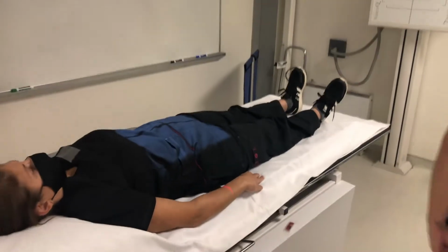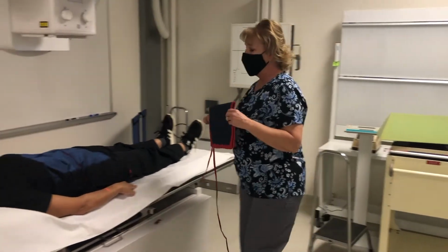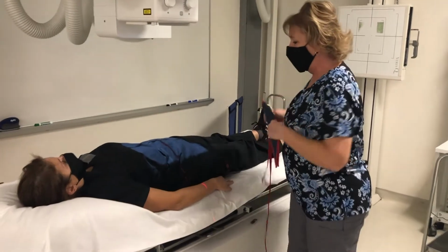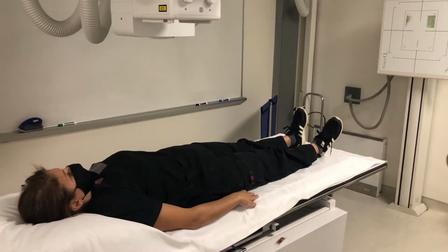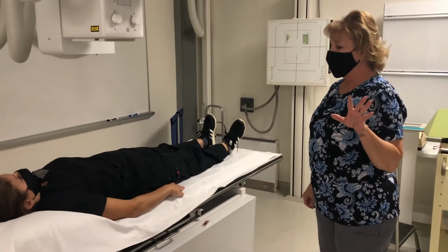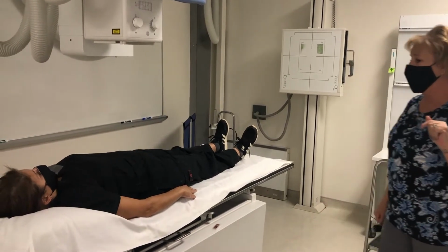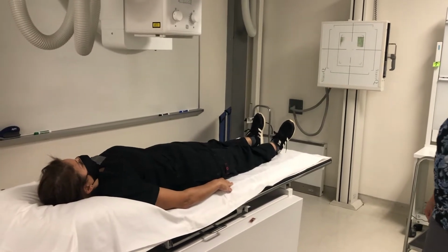Shielding per department protocol. If this was a male patient, I could shield. Female patient, I really can't because I do need to see her bladder, but if you had a male patient, you could place a shield below the field of view. All abdominal x-rays are done on exhalation, so Raina, I need you to take in a breath, blow it all the way out, keep it out, stop breathing, and expose.